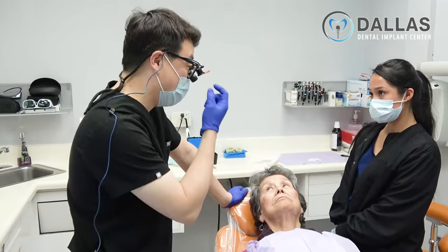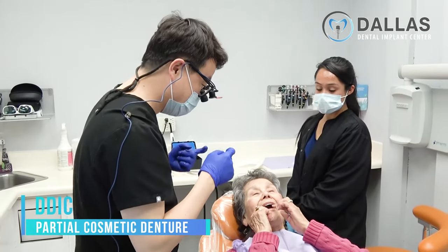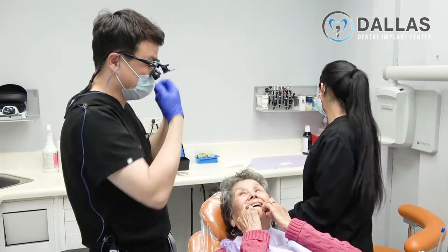So Crystal, have a mirror and help her to see, and then she has to use her finger. And then, there are two metal clasps. You need to show her where the metal clasp is, and then push it down.